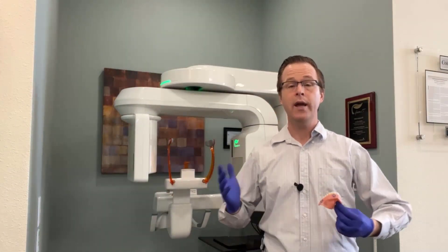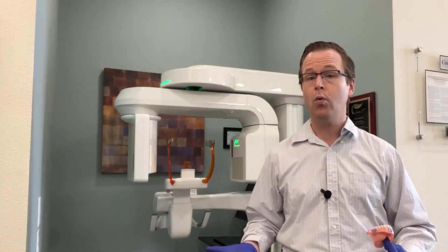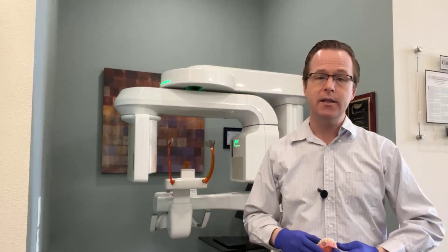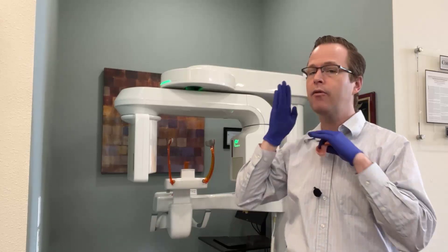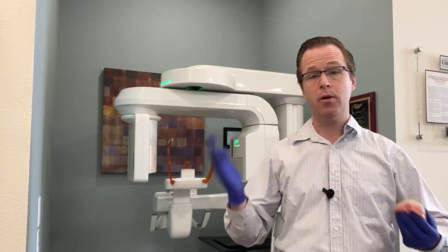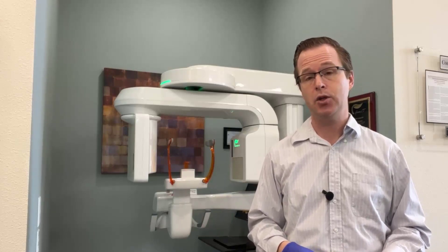Now we're ready to go ahead and place the denture back into the patient's mouth and cone beam scan the patient wearing it. At our cone beam machine, we have everything set up to make a CBCT scan of the patient wearing the prosthesis. Typically our cone beam scan is going to be in the range of a 12 by 9 field of view or something larger. We want to capture from the top of the maxillary bony ridge where it intersects with the nasal cavity down to just below the mandibular ridge. The 12 by 9 more or less captures the vast majority of what we need. A 15 by 15 or similar is also a great choice.